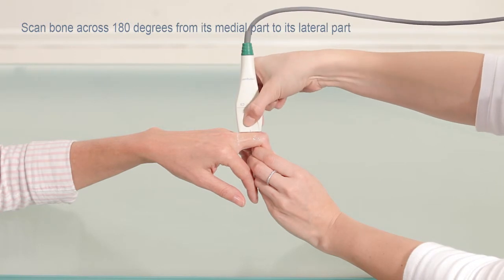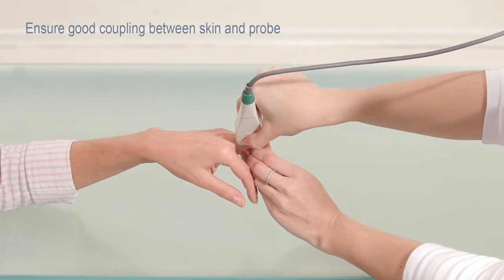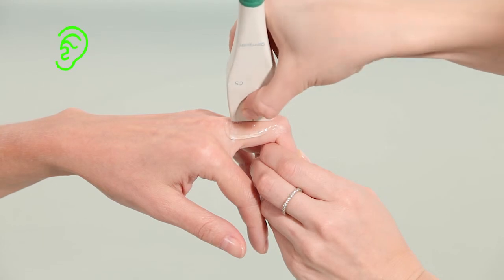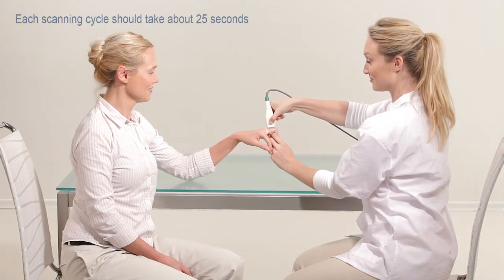Scan the bone across 180 degrees from its medial part to its lateral part. Ensure good coupling between the skin and probe at all times. A beeping sound confirms that you are measuring correctly. Each scanning cycle should take about 25 seconds.